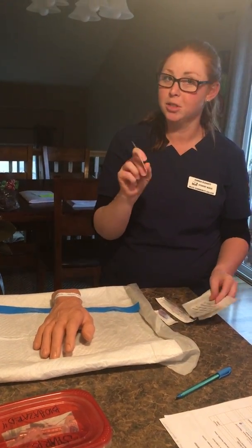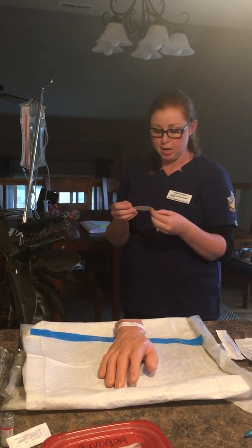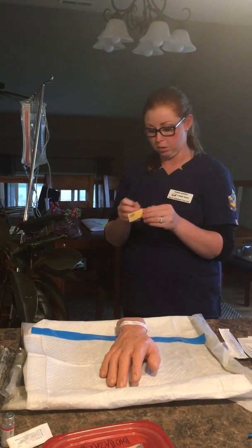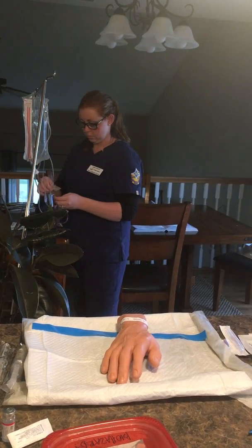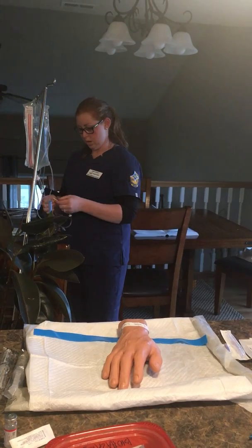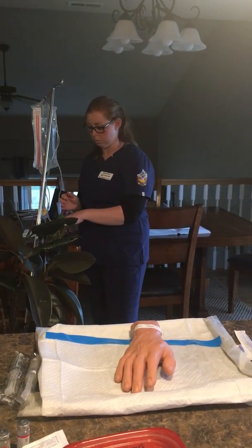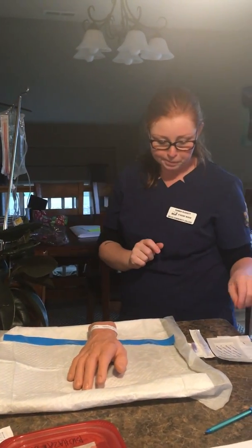You know what I forgot to do is label my tubing. I have it pre-filled out with the date and the time that I'm hanging it, as well as my initials. So I'm going to go ahead and get that done before I forget it. And these are good for 24 hours. Wrong date on the tubing, but for the sake of the video, we're pretending that it's the right one.